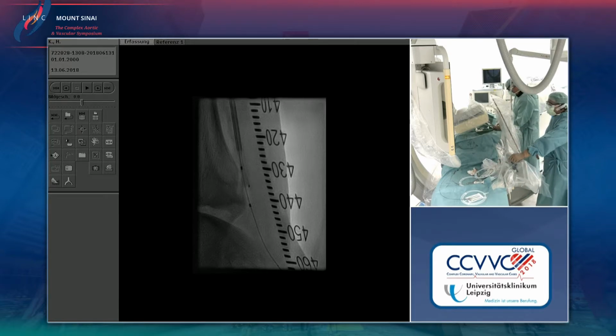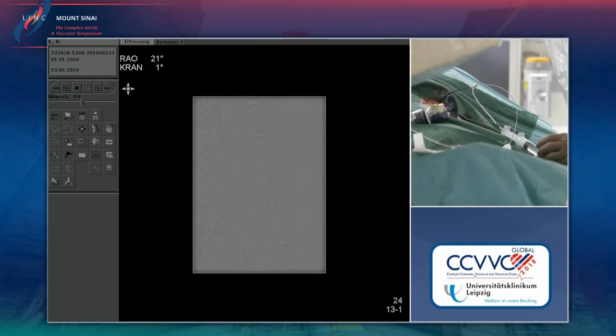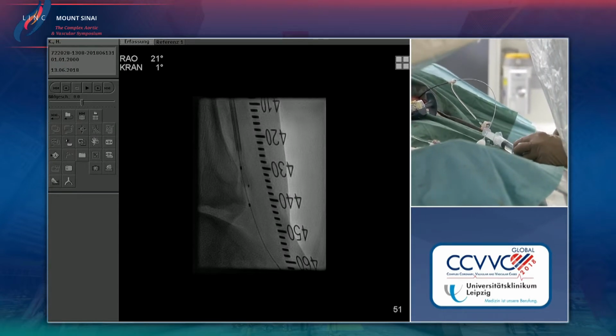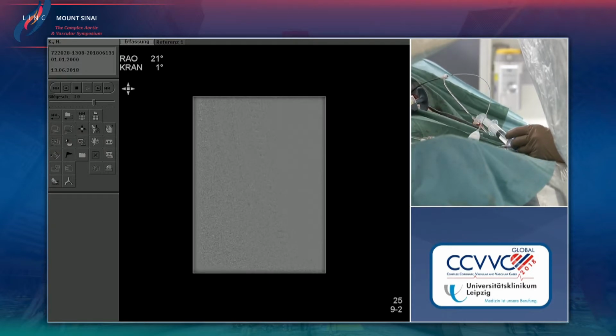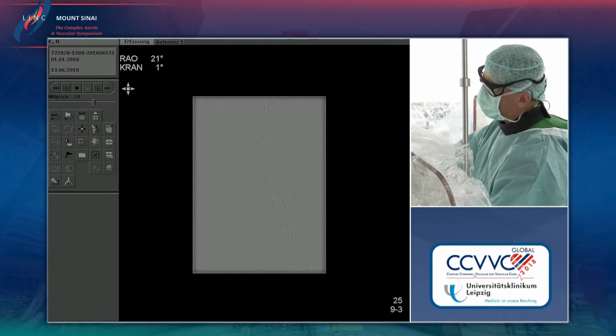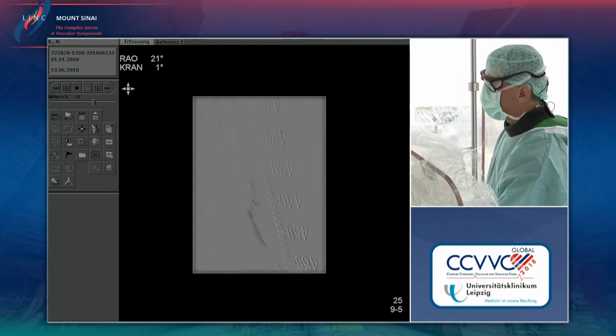Now I'm ready here to inject 0.25 milliliters or maybe a half a milliliter here into the artery. For demonstration I will do it in DSA. That's the easiest way to, oops, something was wrong here. Once again. Yeah, here you could see a little bit of contrast mix went into the arterial wall, but you can see the contrast going down. That means at that point the needle did not really penetrate the calcification.